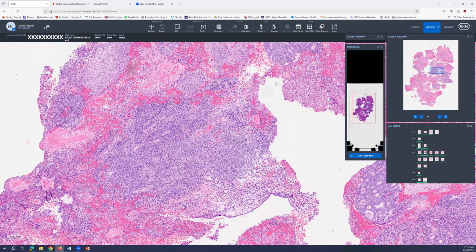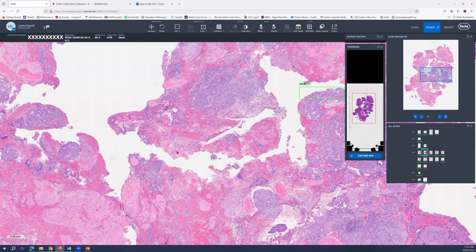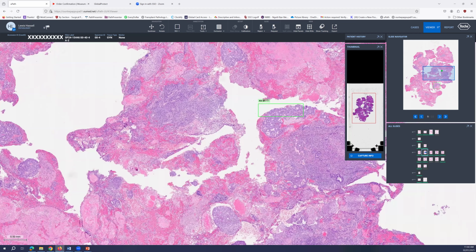So with this pattern, the picture began to come clearer to me as we realized that we had a low-grade endometrial carcinoma coupled with a diffuse high-grade sheet-like pattern of growth going on.